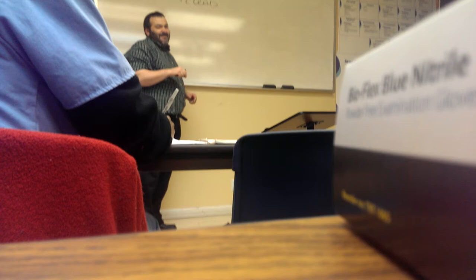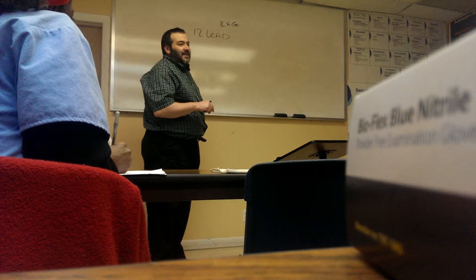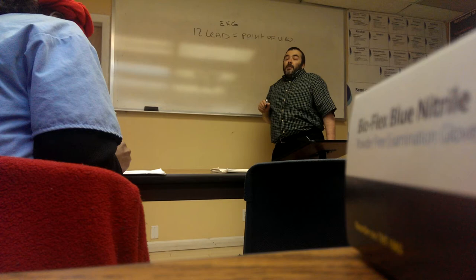Now, we have to define the word lead. So, 12-lead EKG. The definition of the word lead: lead in this particular case equals a point of view. Because we're going to examine the heart from 12 points of view.